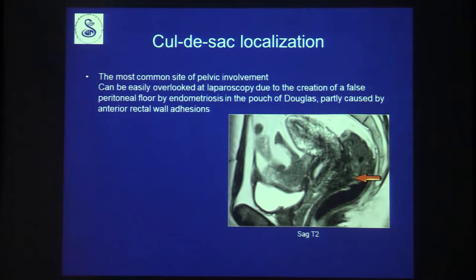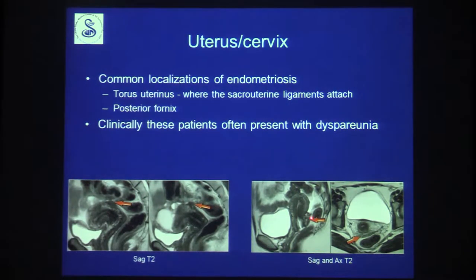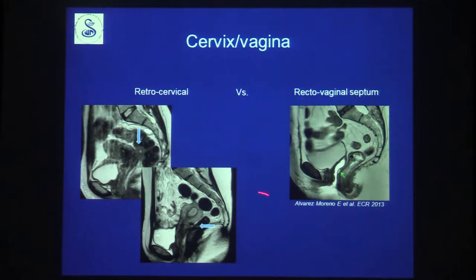The torus uterinus — where the sacro-uterine ligaments attach — is a very common site. The cervix and posterior fornix of the vagina are also common locations. When gynecologists refer to rectovaginal endometriosis, they often mean retrocervical. Opacification of the vagina can make lesions much easier to identify. If the uterus is retroflexed, retrocervical lesions are much more difficult to find, especially when small.